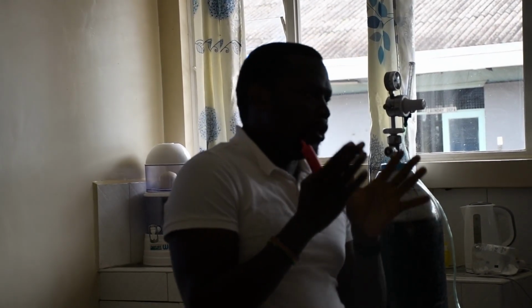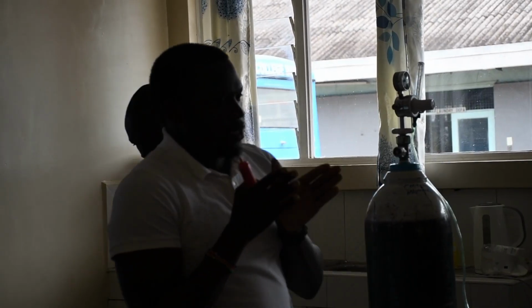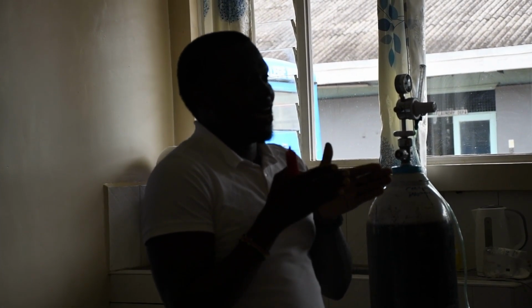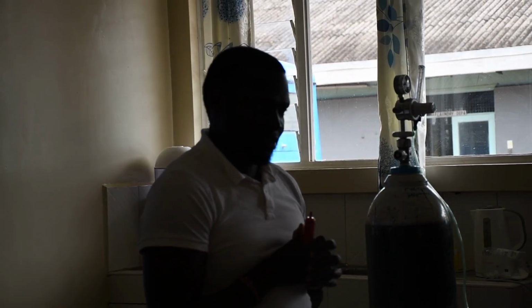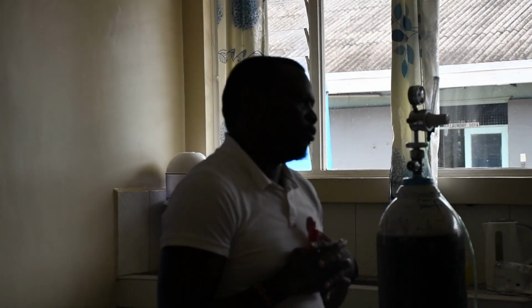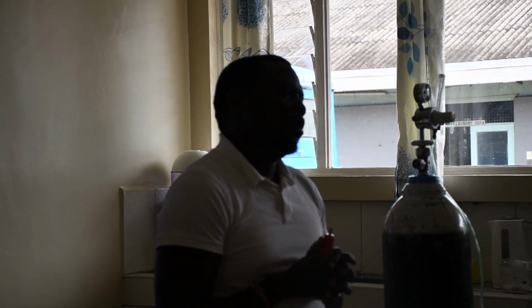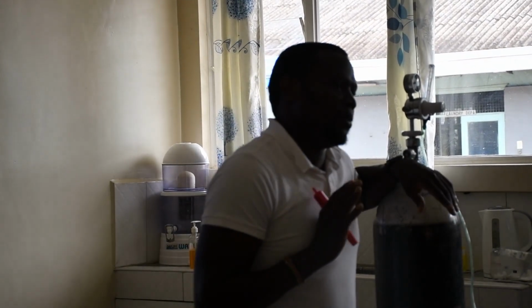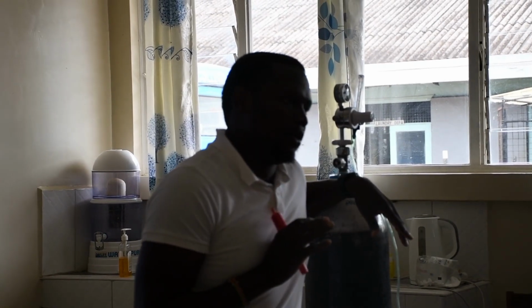Okay? So what we're doing here is, at no given time do we want our neonates to be receiving 100% oxygen. Okay? So the recommended is up to 60. You can move to 70, but that is a lot of clinical decision making. When you're moving past that, now CPAP is failing, and there's CPAP failure.